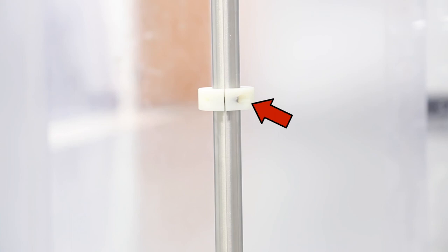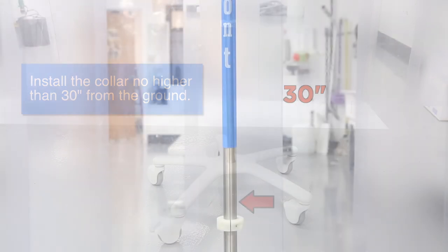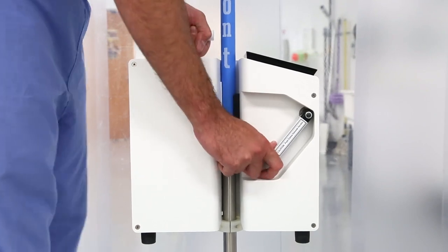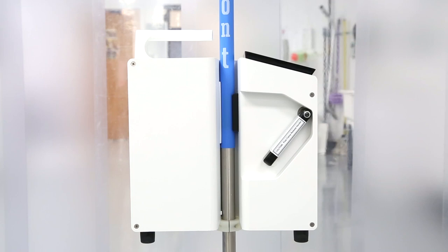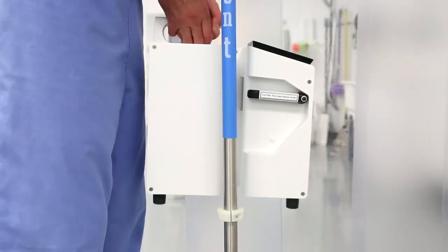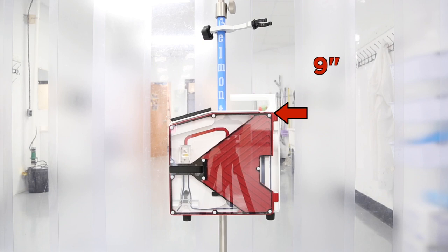First, install the collar on the IV pole just beneath the system, no higher than 30 inches from the base of the IV pole. Mount the system above the collar by pushing down on the pole release handle. Check that the system is secure before proceeding. To remove the system, lift up on the pole release clamp while holding onto the top handle. This will prevent the system from falling. Install the small reservoir support approximately 9 inches above the top of the system.